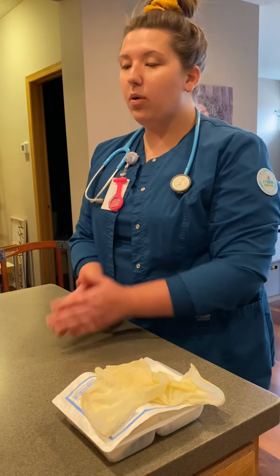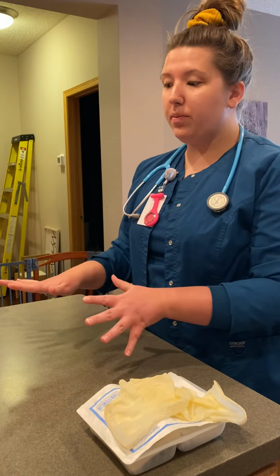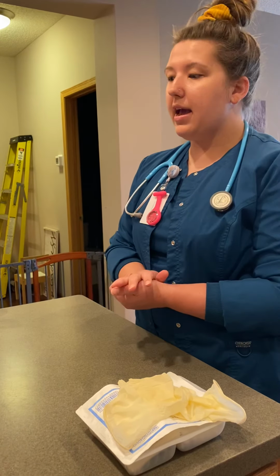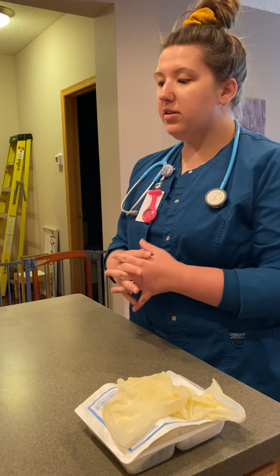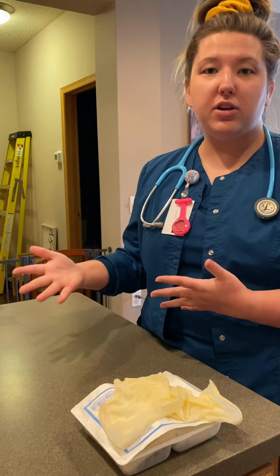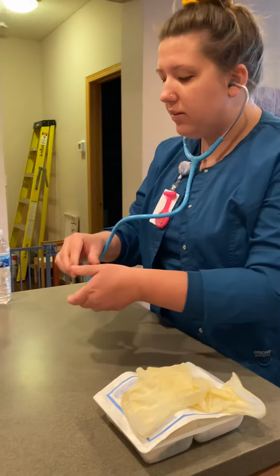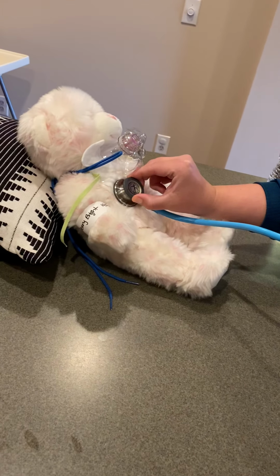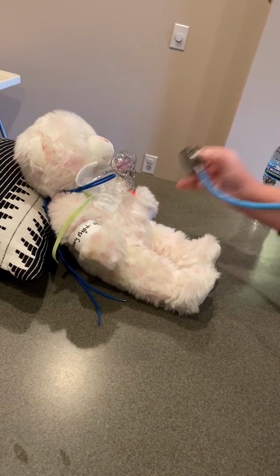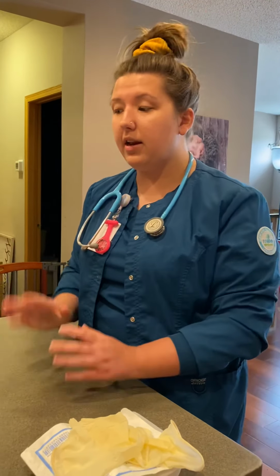Okay, so I'm also going to wash my hands, provide privacy, ensure that the patient is in a comfortable position, but also within working height for me, and I'm going to make sure the bed is locked, and we're going to get started. So I'm going to do a quick assessment here, which is going to assess the need for suctioning before we do the cares. So I am going to take a quick listen to the breath sounds, and so I'm going to listen to the lungs here. Okay, everything sounds clear, but I'd be listening for adventitious breath sounds here, and everything's good.